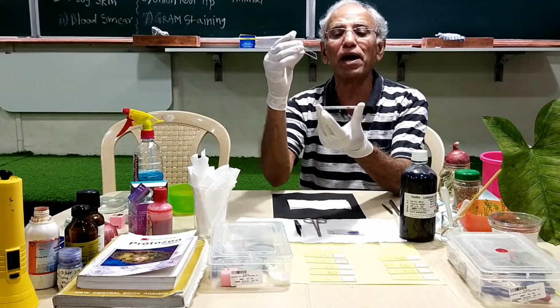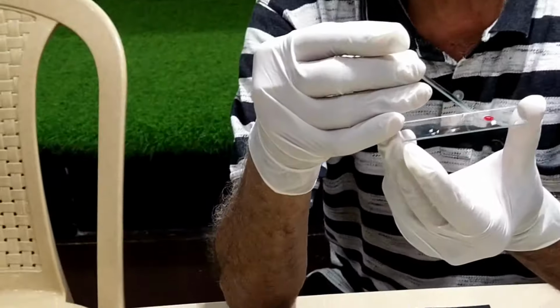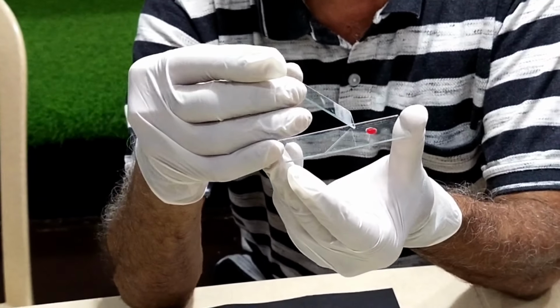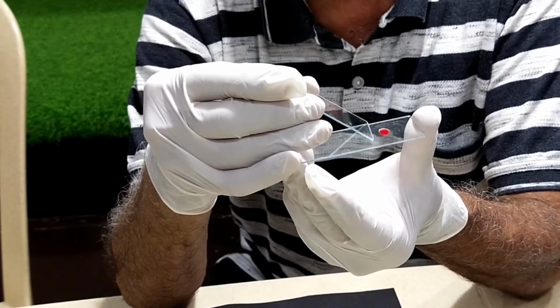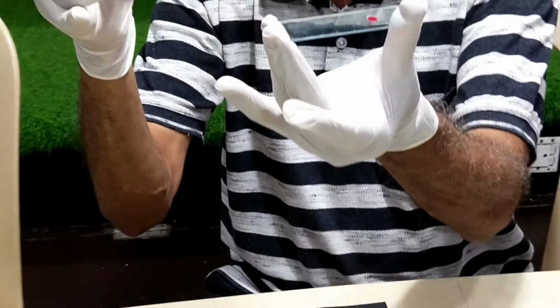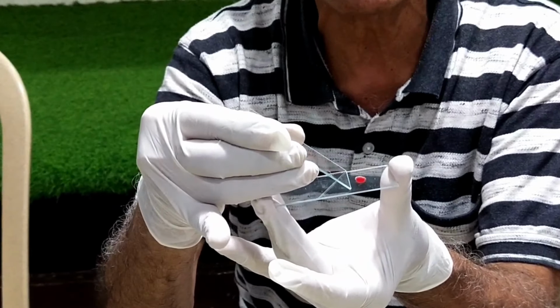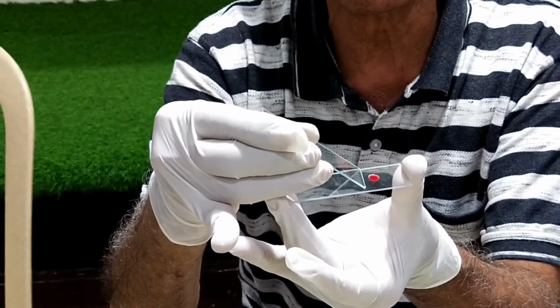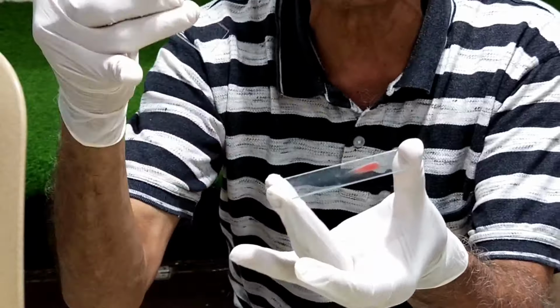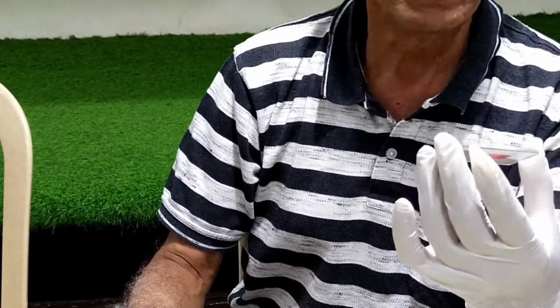So here is a drop of blood. Now see what I am doing. I am trying to now put this spreader a few millimeters away from the drop of blood, and see the way I'm holding it. I'm just putting it a few millimeters away from the drop of blood, and as I showed you, I'm just moving it up and then quickly behind. Oh, not a very good spread, but I think it's okay.